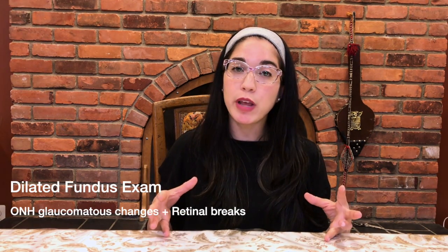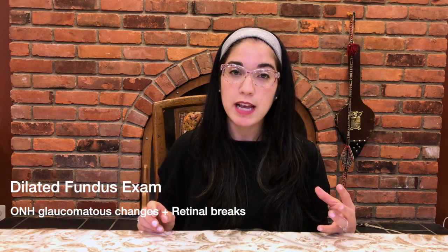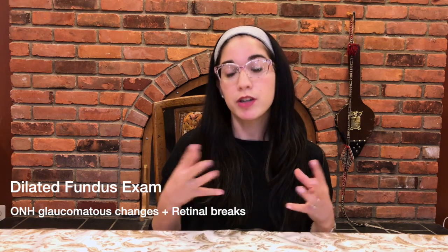Okay, after you do your gonioscopy, you're going to dilate that patient. 2 things to be aware of. First of all, obviously, pigmentary dispersion syndrome is a secondary cause of glaucoma, so you want to pay close attention to the optic nerve and probably run some imaging. We're not going to go through imaging in this video. The other thing that you have to be aware of is that pigmentary dispersion syndrome has a tendency to be associated with retinal breaks and lattice degeneration.